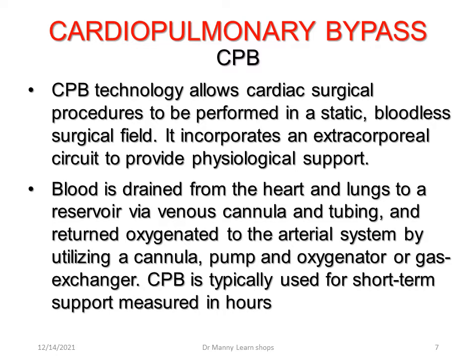The next stage during cardiac surgery is cardiopulmonary bypass. This is a technology that allows cardiac surgical procedures to be performed in a quiet, motionless, static, bloodless surgical field, so the surgeon can see what he or she is actually doing. It incorporates an extracorporeal circuit to provide physiological support.